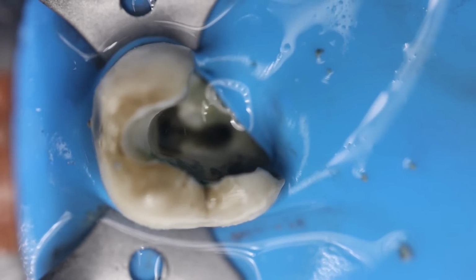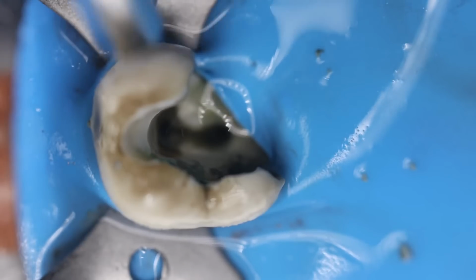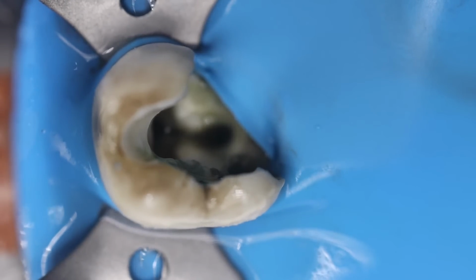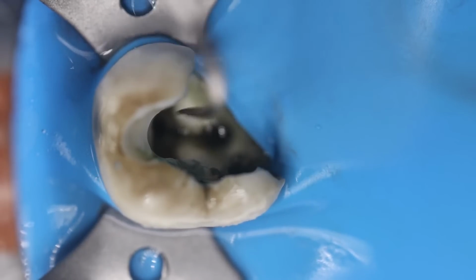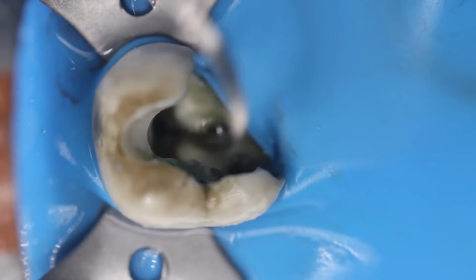Now you can easily visualize that there is a darkened area once we clear this. So now you can visualize that there is a dark area roughly depicting the dentinal map, depicting the orifices.